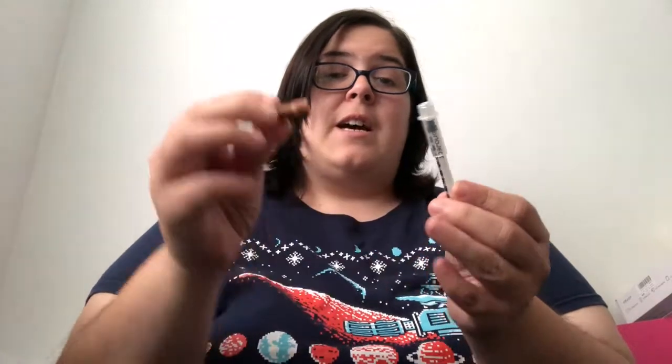This tuberculin needle has the same safety feature. This barrel is just a little bit smaller, but it does have the same safety feature. Again, do not do this. Just use the safety feature. It's so easy, and it's a lot better for you if you choose to do that.